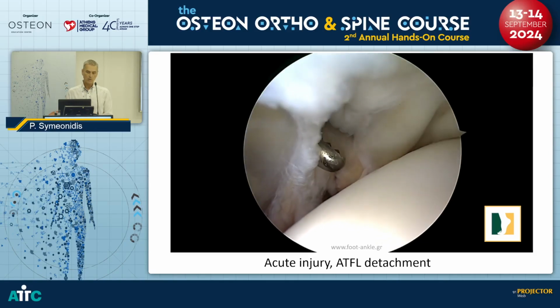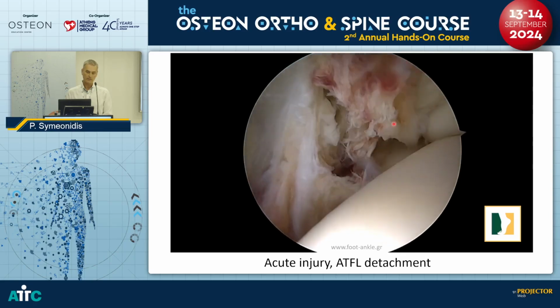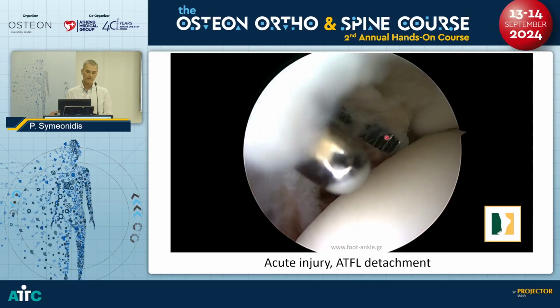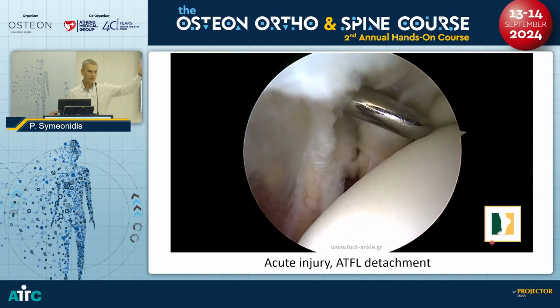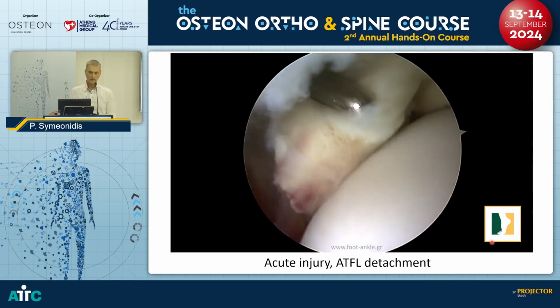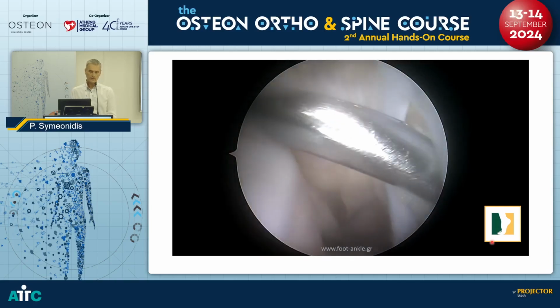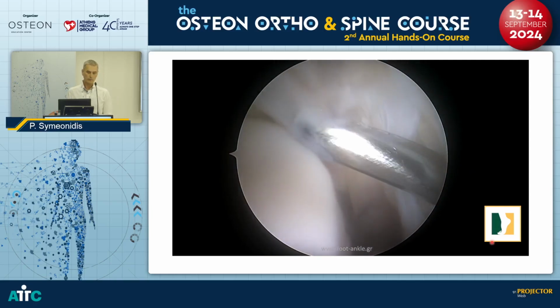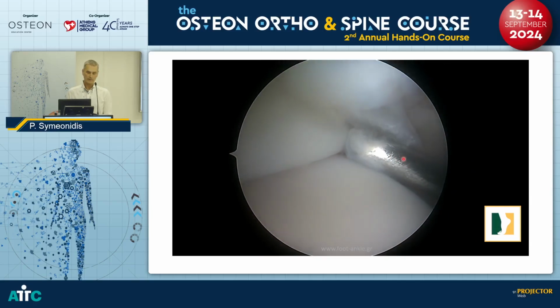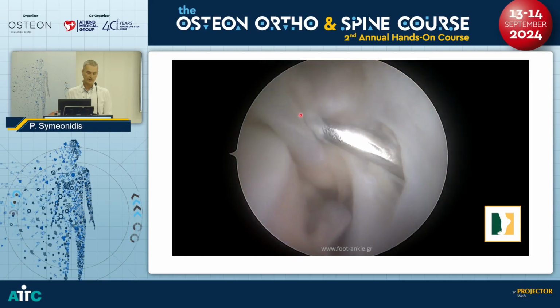And here we will catch, this is a detached distal stump of the ATFL, and the insertion of the ATFL, the origin, is intact. And this patient had also a syndesmotic injury. So this is how we're trying to do the arthroscopic Broström. That's the Bassett ligament, that's the Nicolopoulos ligament, that's the inferior syndesmosis, which is intact in this instance.